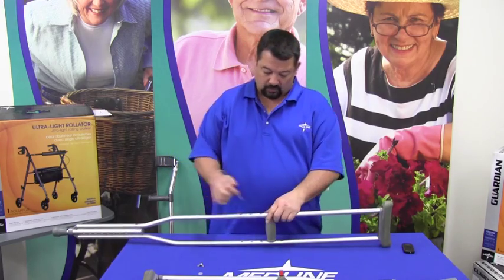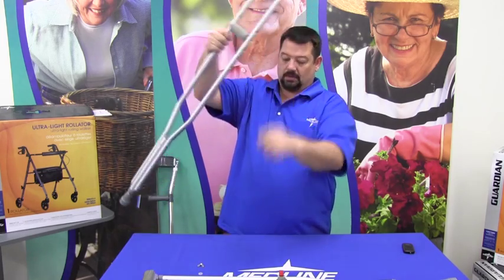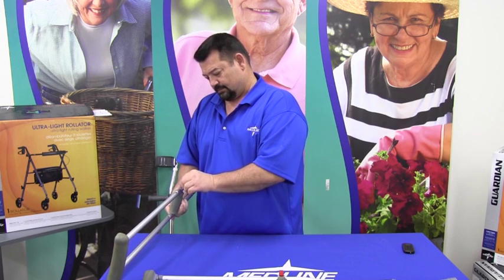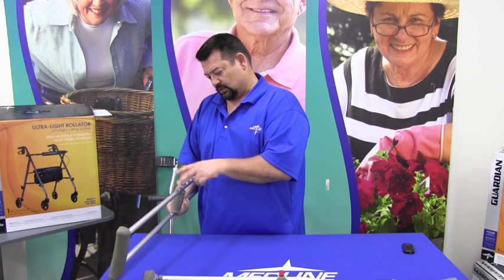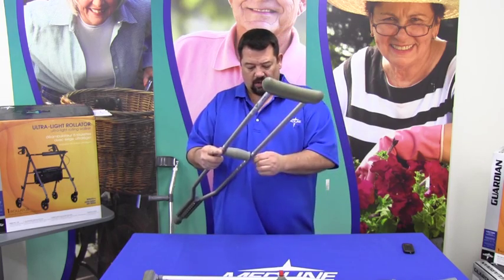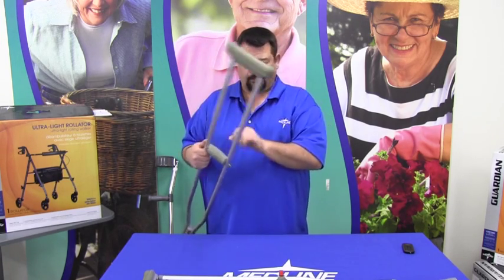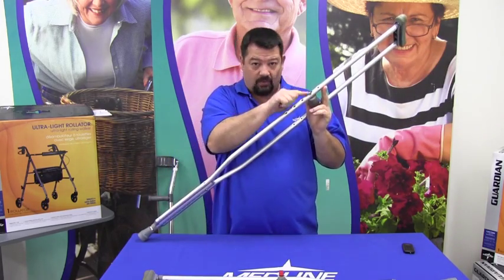find the closest hole, put the bolt back through it, washer, wing nut, and that's the size. Now, you don't have to tighten it down so tight that you're going to break these little wings off the wing nut. Snug. That's the sizing.